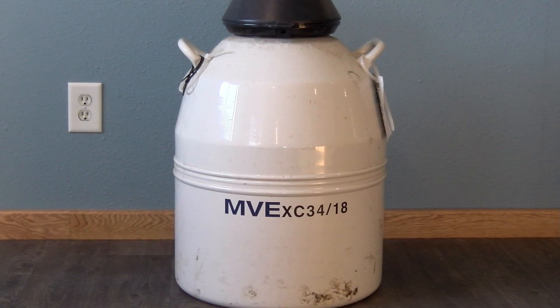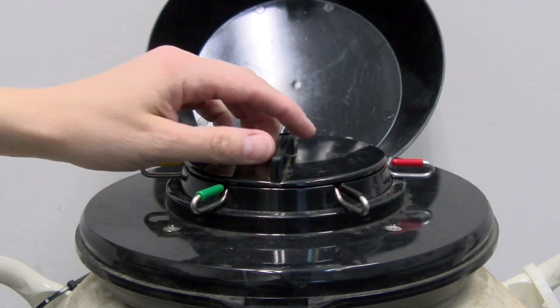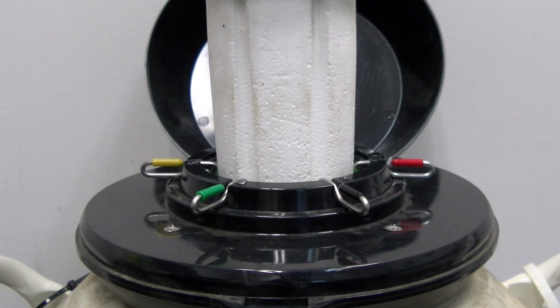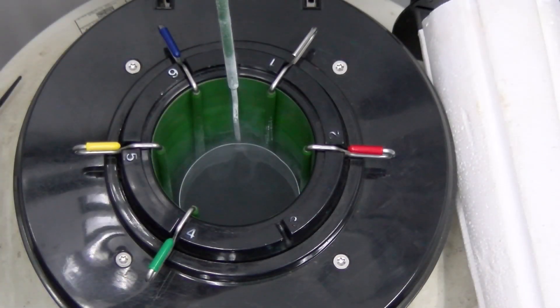A liquid nitrogen tank is a double-walled container in which two tanks are fused together with a fiberglass neck. A hinged lid covers the tank canister area and a styrofoam cork fits loosely in the tank neck. Stainless steel canisters hold the semen canes in the tank and have handles that rest on the outside of the tank.